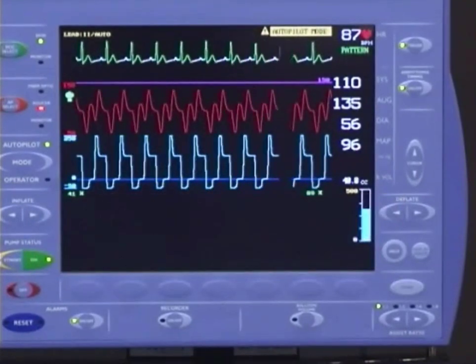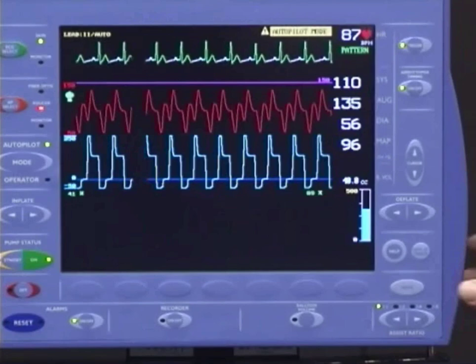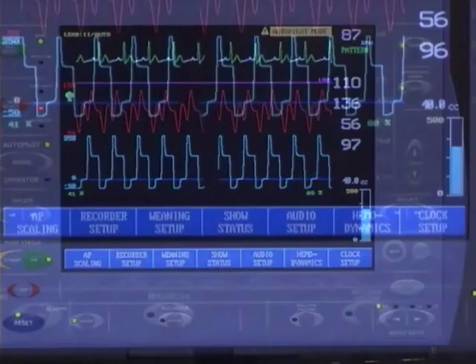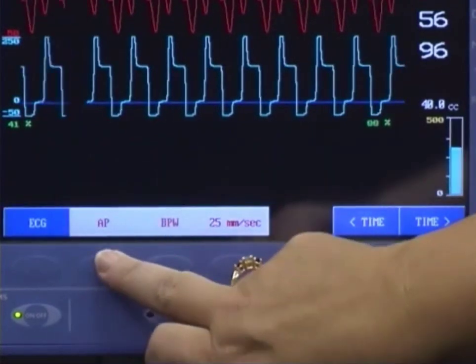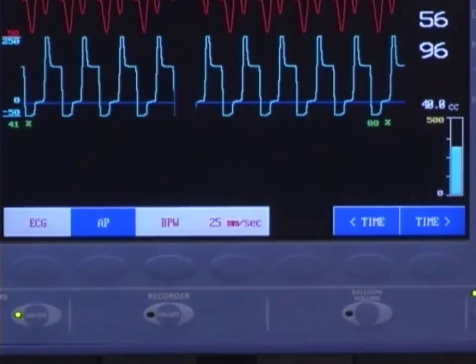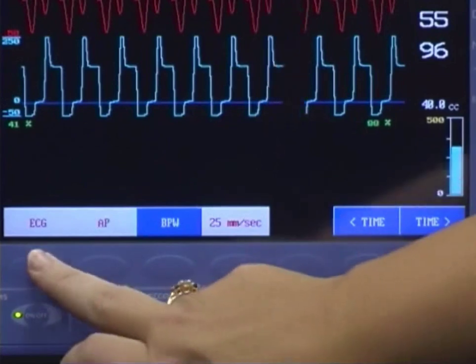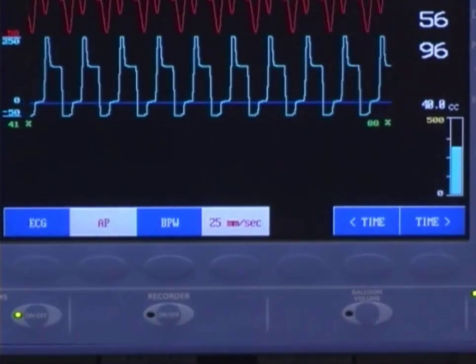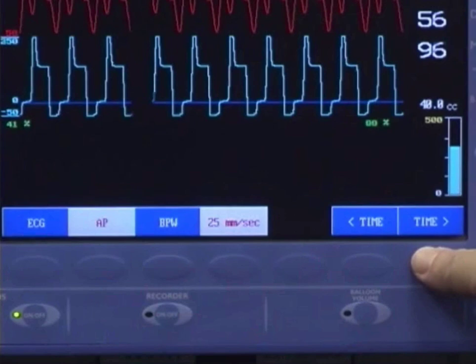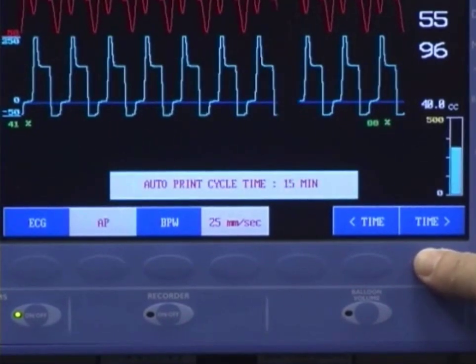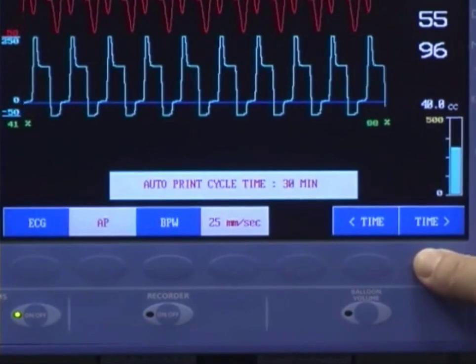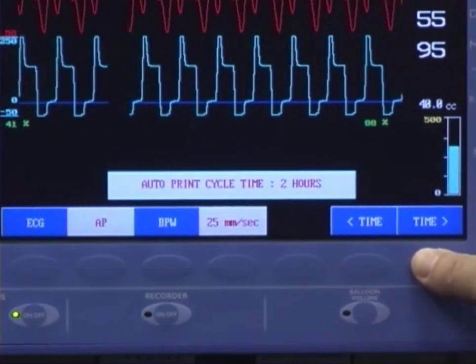You can change which waveforms are printed. To do this, press the Home key, then select Recorder Setup. You can set the recorder to print any combination of two waveforms or just one waveform. The white highlighted choices are those that are currently selected. In addition, you may set the recorder to automatically print strips at given time intervals using the time keys. The options are every 2 minutes, 15 minutes, 30 minutes, 1 hour, 2 hours, and 4 hours.